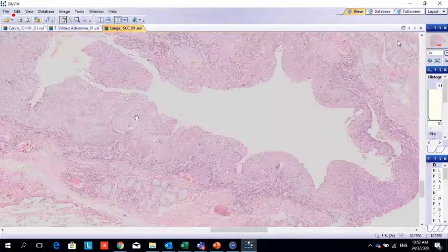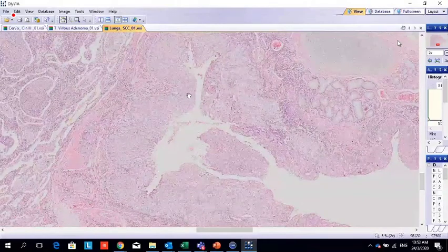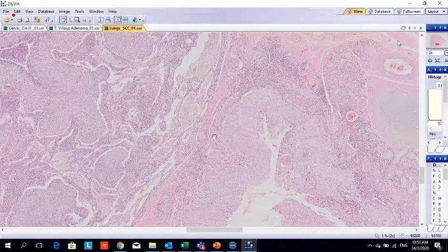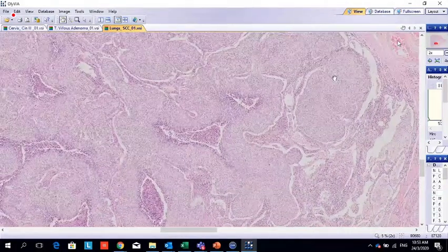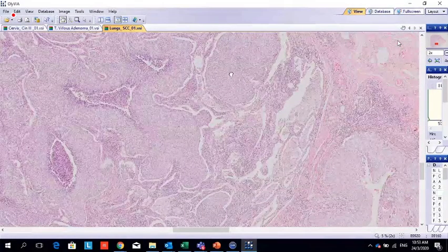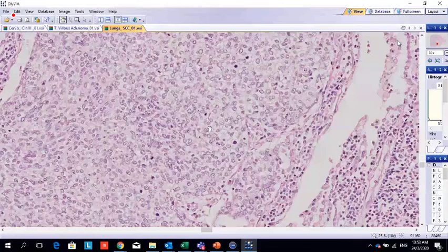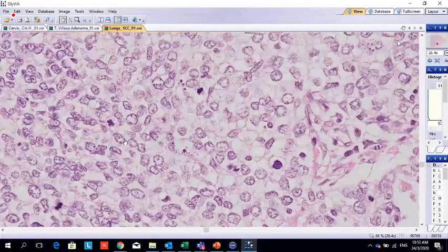Then with the patient still continuing smoking, this carcinoma in situ or severe dysplasia progresses to what? It invades the wall and reaches the alveolus. Understood? So this is the tumor within the alveoli, already invading the wall of the bronchus and invading into the alveoli. So this is what you call infiltrating carcinoma. So what type of cancer is here?